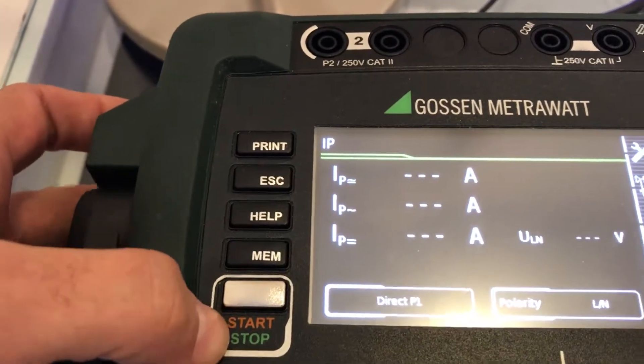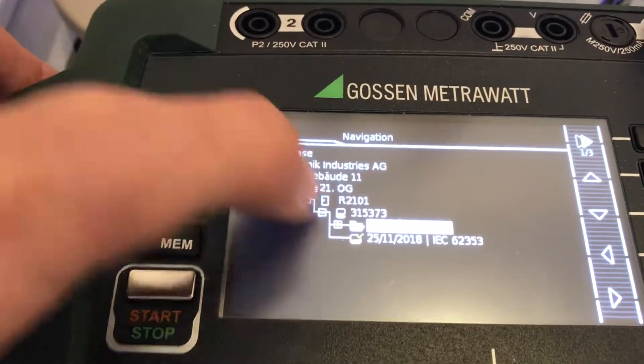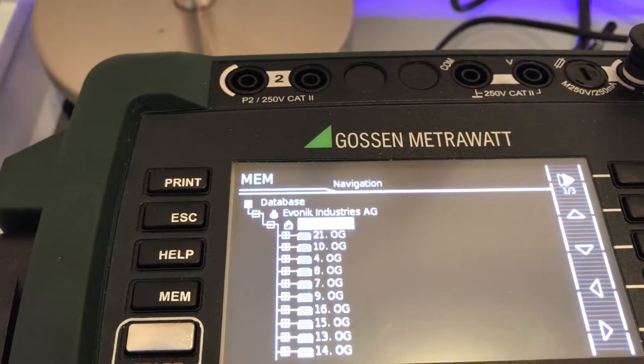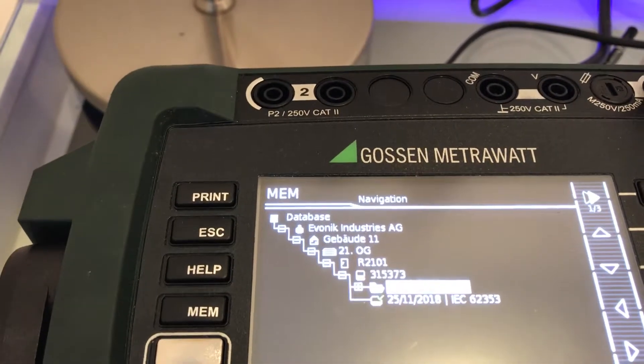We also have a start/stop button up here, and we have the memory for handling the memory itself. The database structure allows us to have a huge database in here, which can store a wide range of devices on test.